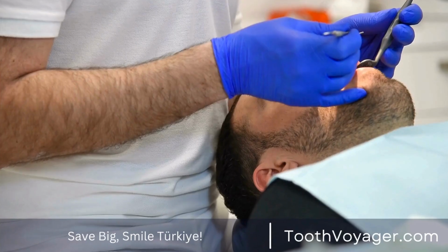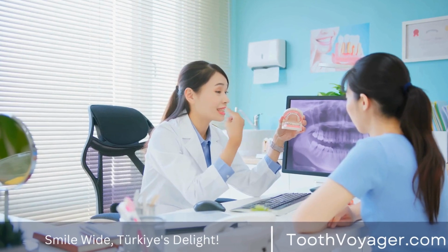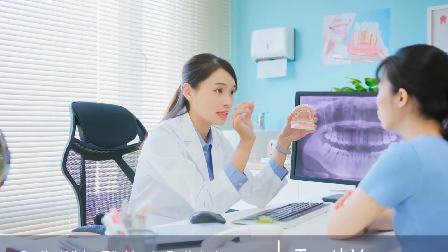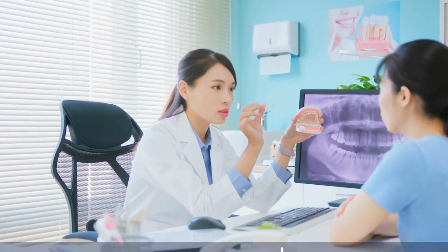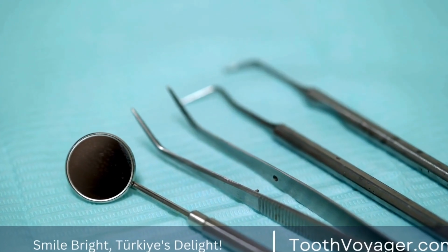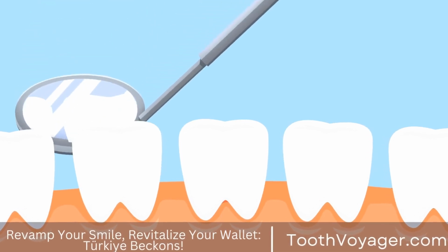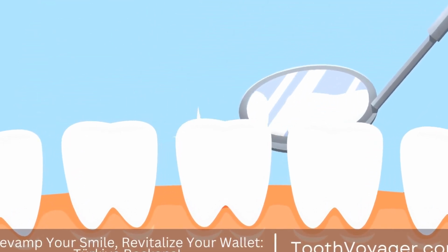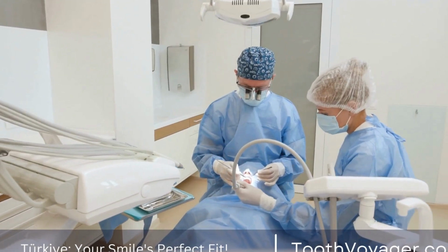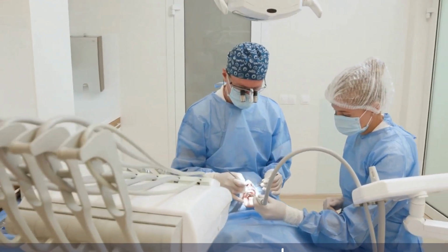4. Zygomatic implants. Zygomatic implants are a different kind of dental implant that is utilized when conventional implants aren't an alternative due to reduction in bone density within the jaw's upper region. Instead of being inserted into the jawbone, zygomatic implants are fixed into the zygomatic bone. This is more dense and offers an extra secure base to the implants. Zygomatic implants can be a great alternative for those who have been told that they aren't suitable for conventional implants because of bone loss within the jaw's upper region.